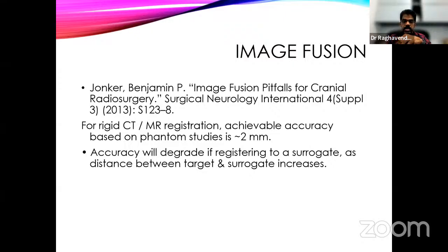The data from CT to MR registration in the phantom study shows an error of not less than 2 millimeters. So this much inaccuracy is always there. Why I'm saying all those inaccuracies in a quantified way is that in most of the centers I have seen, especially when they are doing stereotactic works and linear accelerator based stereotactic works, they come and say, I want just the GTV to be planned, the GTV to be analyzed, and the GTV to be treated.